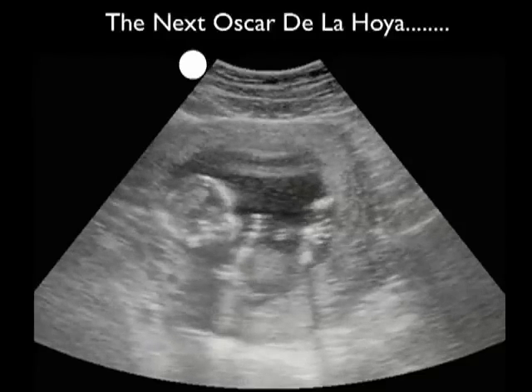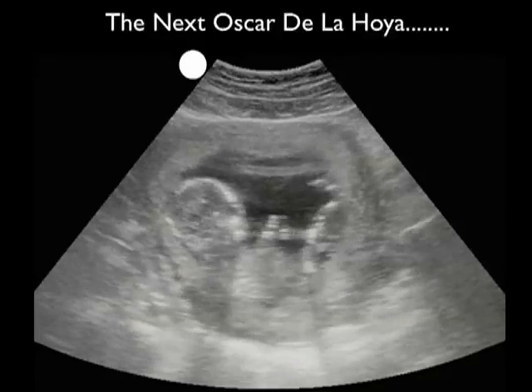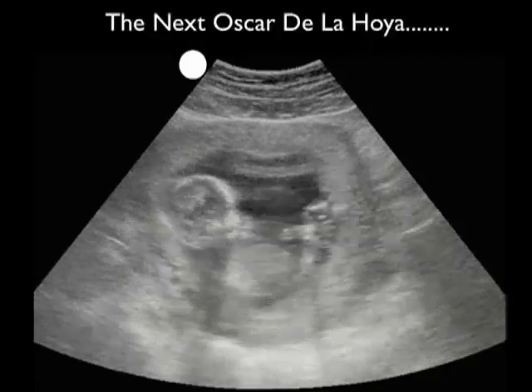Here's an early second trimester pregnancy. What we see here is the next Oscar de la Hoya. Note the mean right hook on the baby here.